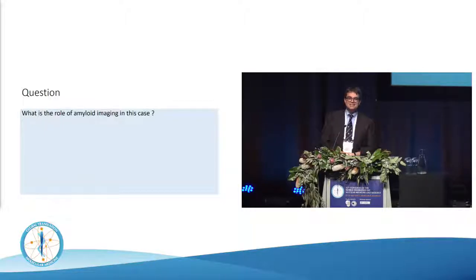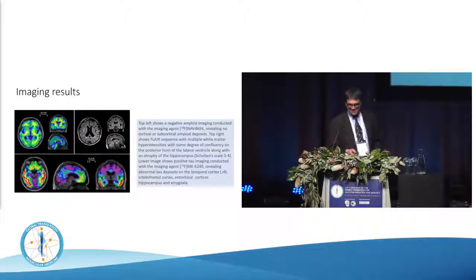Do you think this is a case where amyloid imaging would be recommended, yes or no? Professors? Sure. Well, my colleague on my left would say an FDG PET should be done first. You might have a point. All right. I couldn't get the FDG to bring because it was done under his clinical care. But the diagnosis from the FDG was Alzheimer's disease.